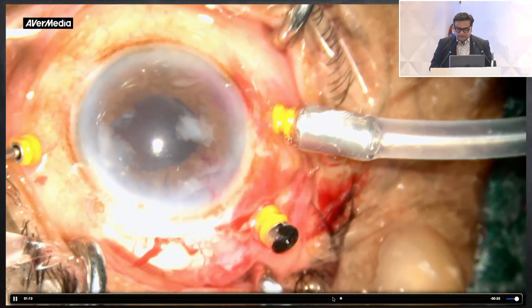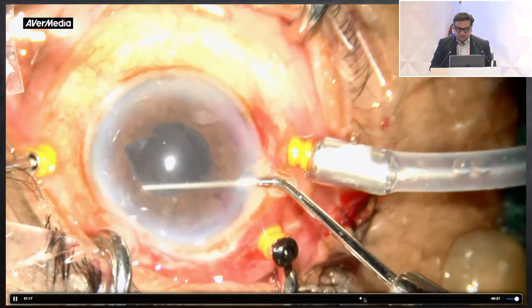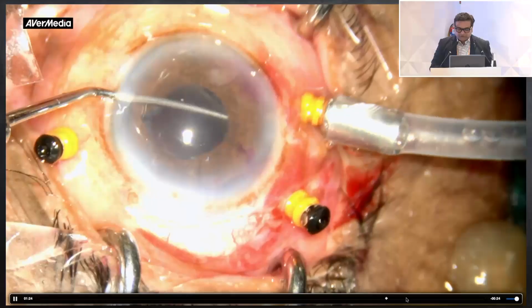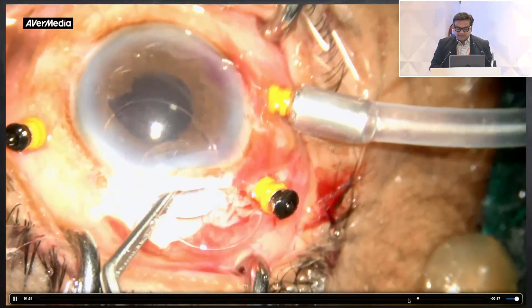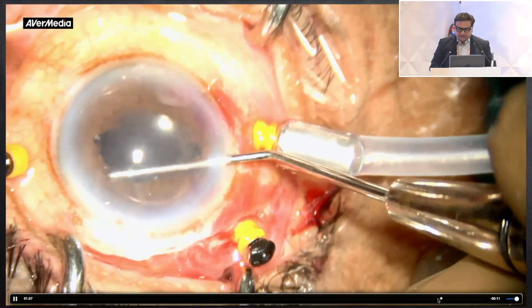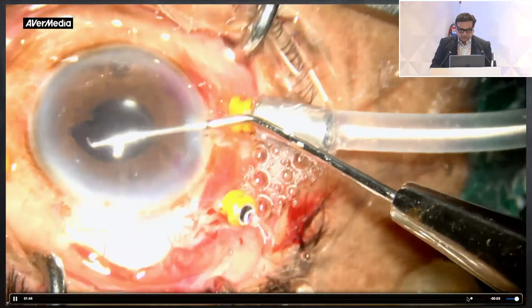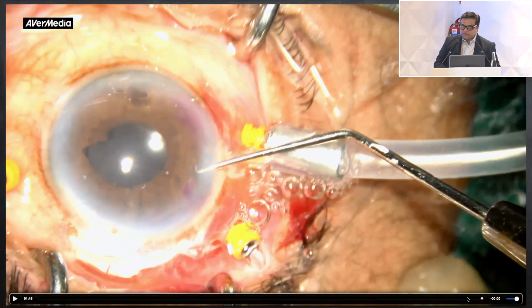Once the nucleus is delivered, you assess the support properly, whether the support is good and if there are any vitreous strands around. If you see any vitreous strands, use a cutter to cut these. The support was good in this case, wherein I decided to put a single piece lens in the sulcus. So these cases really do very well. You don't have to have too many fancy gadgets. It's a very simple technique wherein, always after putting the lens, again check for the vitreous strands.